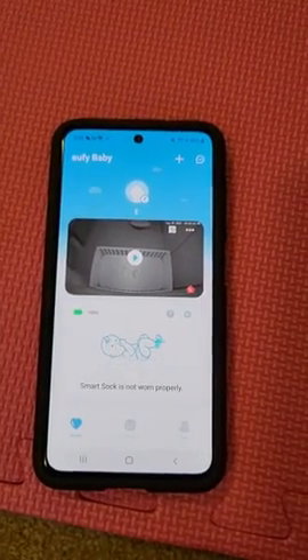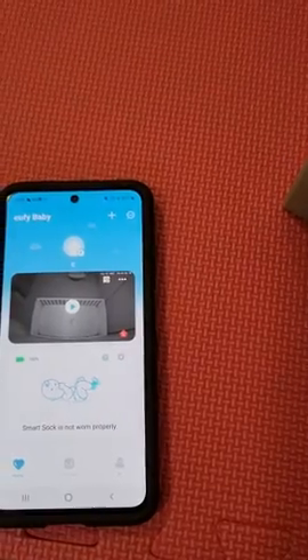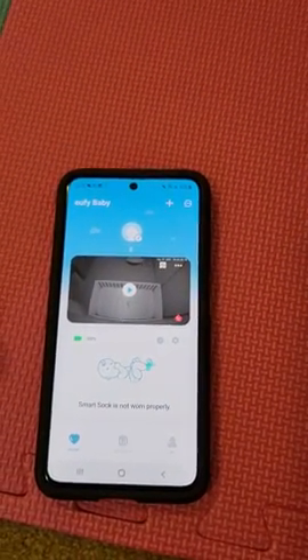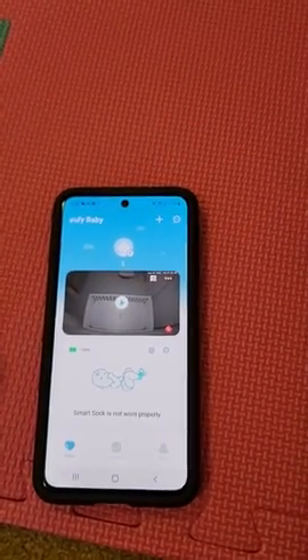This is the Eufy baby smart sock. It's basically a heart rate monitor that your baby wears while sleeping. It tracks their movement, it tracks their heart rate, and it compiles all the data for you.